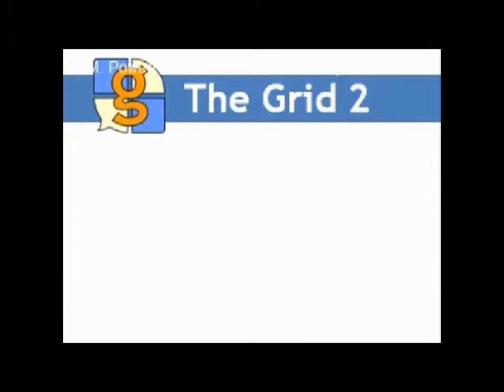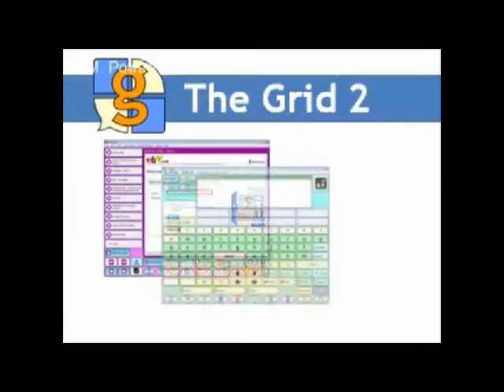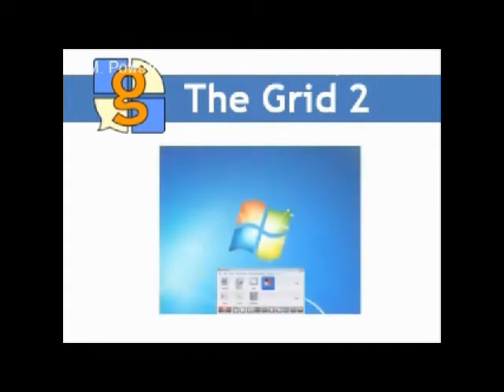The Grid 2 has its own dedicated grids for web browsing, email and SMS messaging, but the lack of dynamic integration with Internet Explorer or Outlook, and very limited functionality compared with those applications, made me persevere with eyegaze control within Windows.